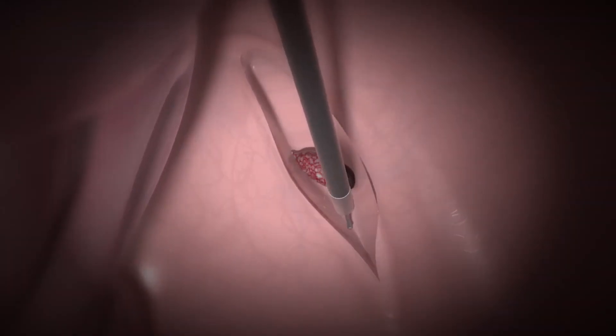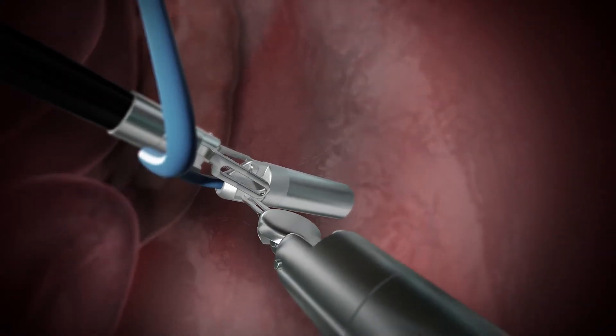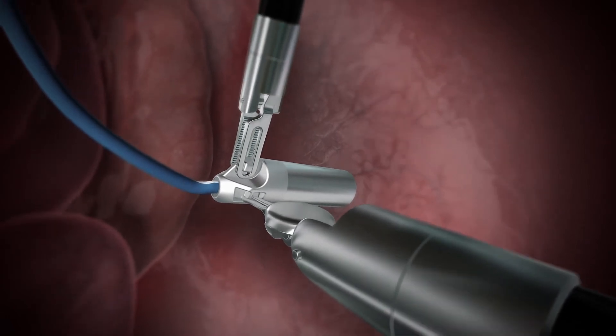Cancer can then be removed and healthy tissue retained. Sensei is designed to be used with tissue graspers, offering multi-grip orientations for maximum agility and unprecedented access.